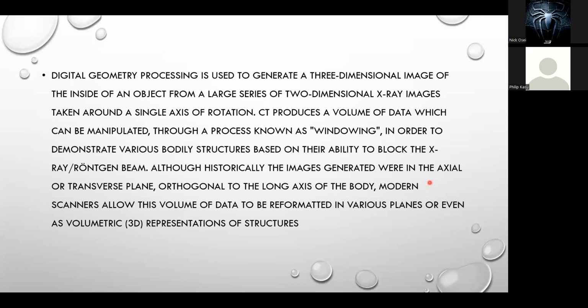Just like we use the periodic table in comparison when we talk about X-rays, here also the density of the material will determine how much of the rays it will allow to pass through.